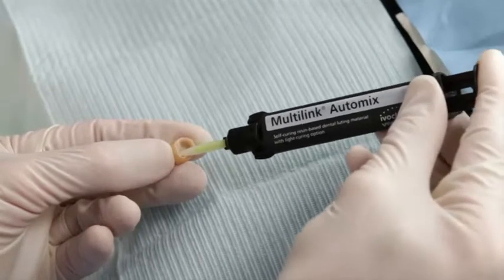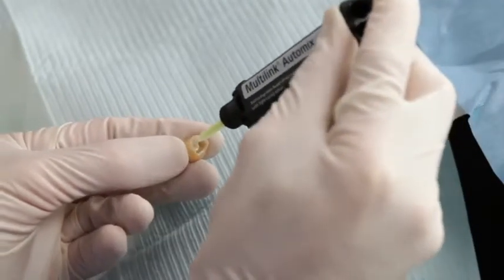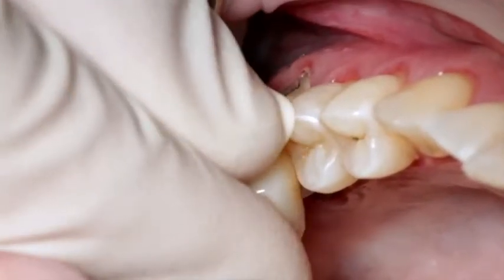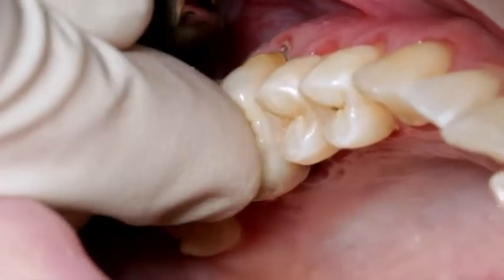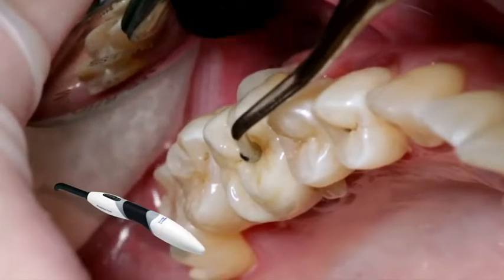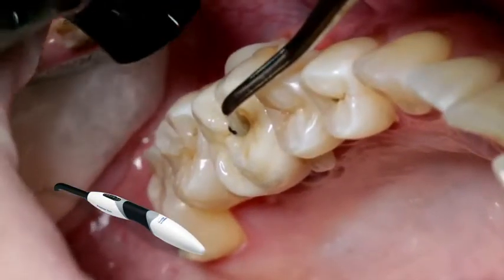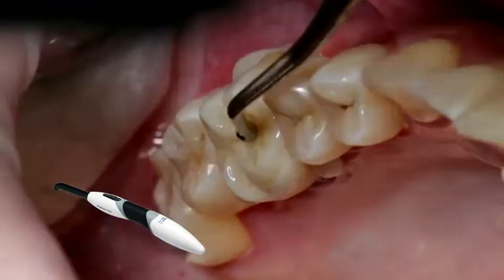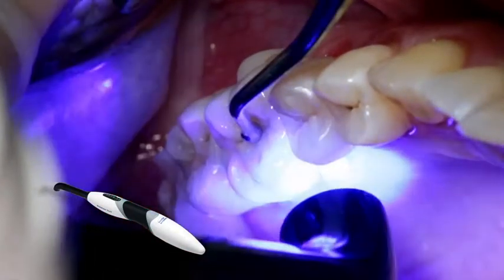Dispense the desired amount of Multilink Automix from the Automix syringe and apply it directly to the restoration. Seat the restoration and hold it in place using light constant pressure. Light cure excess cement with a polymerization light, such as Bluephase Style, for 1–2 seconds per quarter segment, with a light intensity of 1,100 mW per square centimeter.